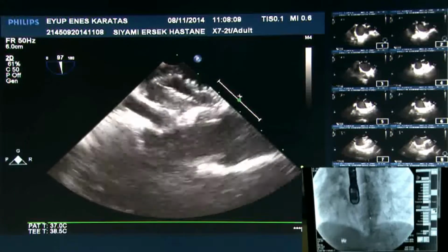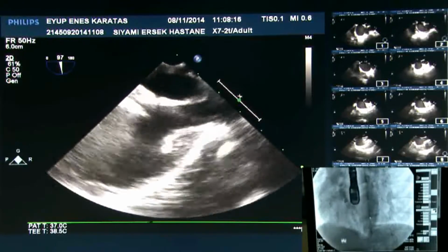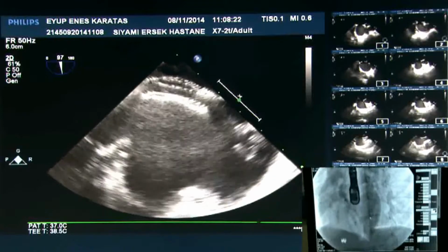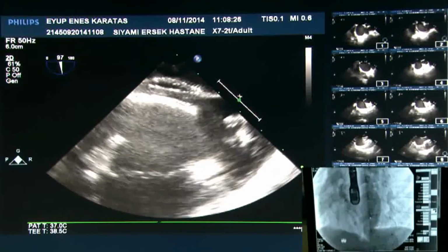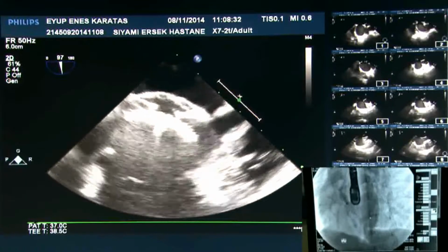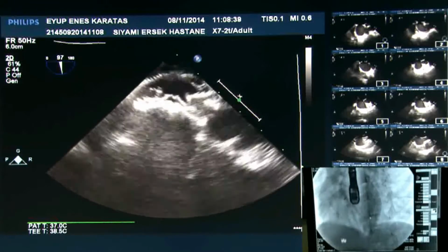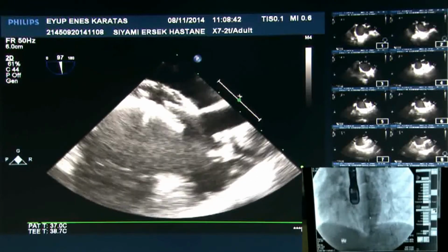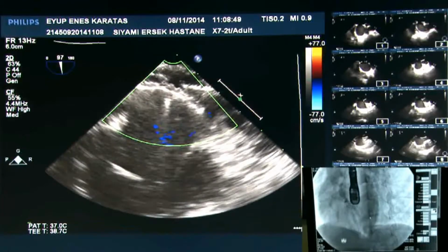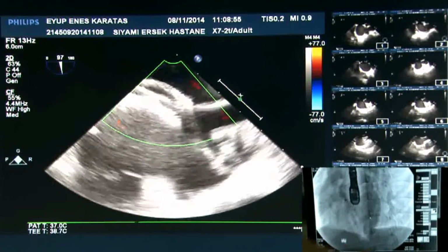But yeah, Felix? Well, I try to make a comment on balloon sizing or echo sizing. In my experience, it's very easy to create a larger defect using the color flow method. It's only depending on the power you achieve. So I can easily create a defect between 12 and 20 millimeter in diameter, just playing with the power of the color flow. And in this situation, if you had used the stop flow method with balloon sizing, I'm more than sure that you would only have measured 14 millimeter. So in this situation, I think 14 millimeter would have achieved the same total occlusion as the 16 millimeter device did with the 15, okay.